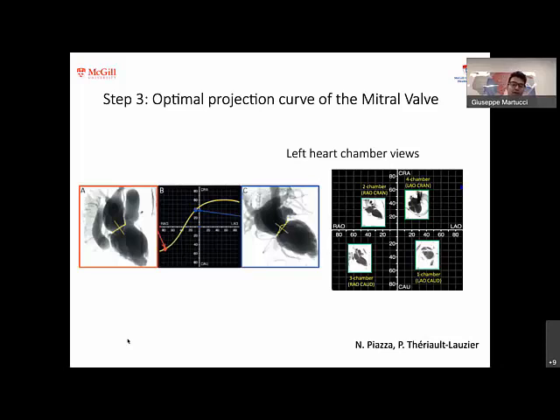Okay, so each quadrant will represent different chamber views, and this is where we begin to correlate the fluoroscopic images with the echo images with the CT images. Okay, and it's extremely important. Now, Echo Navigator does that for you, but you can do that yourself by understanding where those views are coming from.